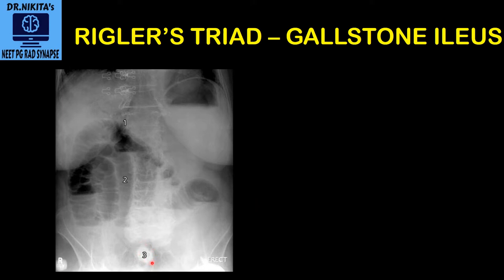If you see the three labeled here, you see something white — that is a gallstone. Basically, a stone which was in the gallbladder has now come into the bowel and got stuck here. The most common site is in the right iliac fossa, the ileum or the ileocecal junction, because it is the narrowest part. You see this round white thing — that is the gallstone.